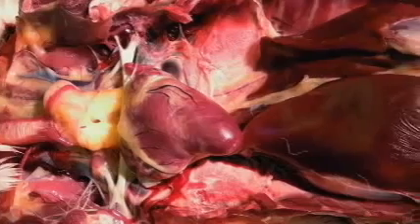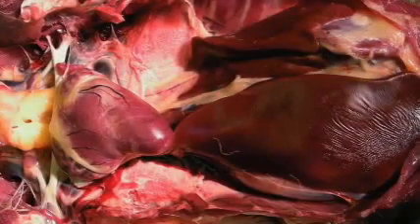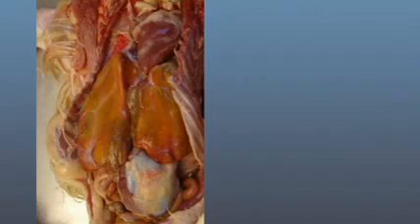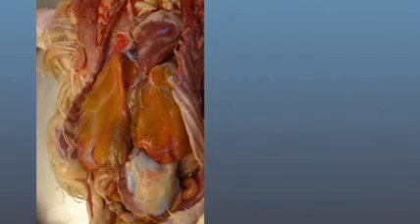In the middle of the coelomic cavity lies the liver. It's very important to examine this organ carefully, as many duck diseases are associated with liver abnormalities. In ducks, the normal color of the liver should be dark red and the texture homogeneous. Amyloidosis is associated with a variety of duck diseases and causes an enlarged yellow to orange-colored liver.